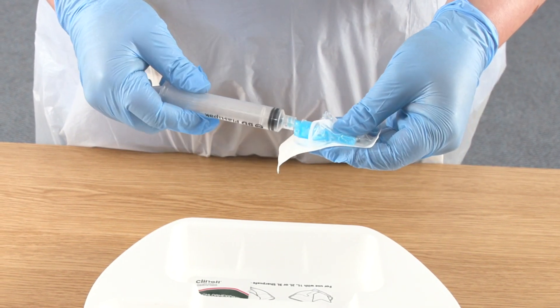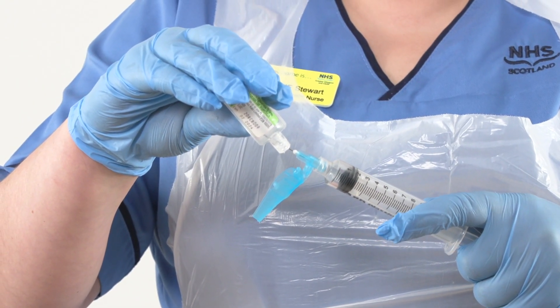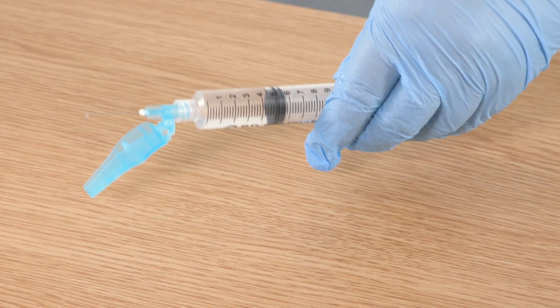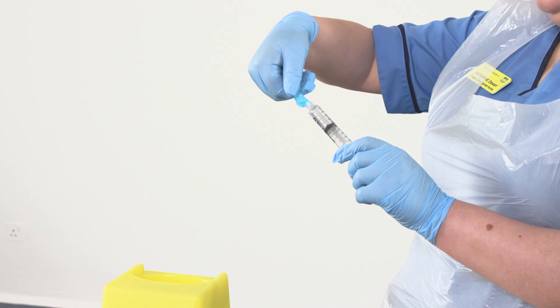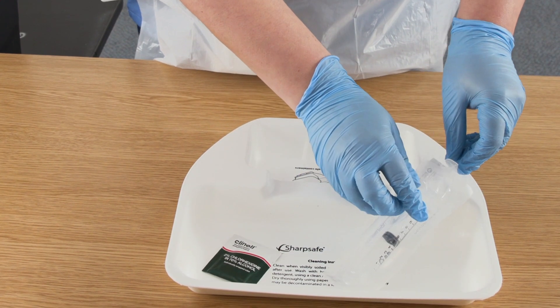While that is drying, I am going to use an aseptic non-touch technique to peel open the hypodermic needle and syringe packets to reduce contaminating the key parts, which in this instance are the syringe tip and hub of the needle. I now need to connect the needle and syringe together without touching the key parts, then open the ampoule and draw up the flush solution. I have drawn up the full 5ml into the 10ml syringe. The safety shield on the hypodermic needle should then be activated on a hard surface. The next step is to remove the needle from the syringe and discard it straight into the sharps bin, taking care not to touch any key part. I can now protect the tip of the syringe from contamination using the syringe packaging as a microcritical aseptic field.